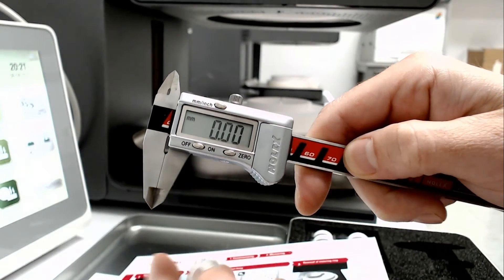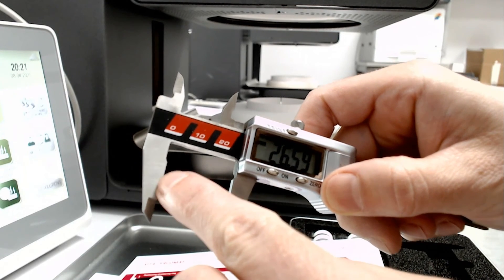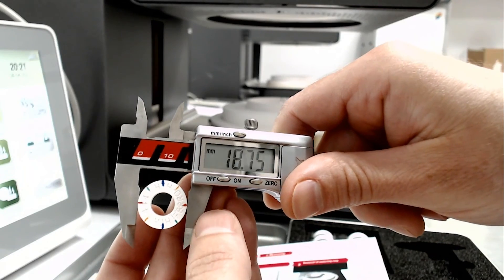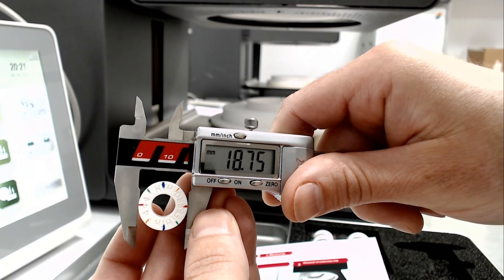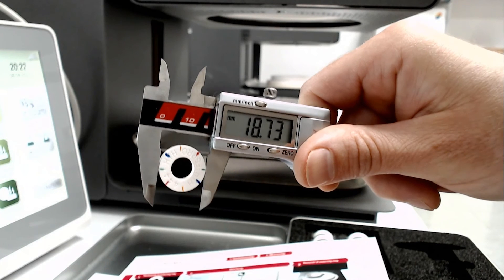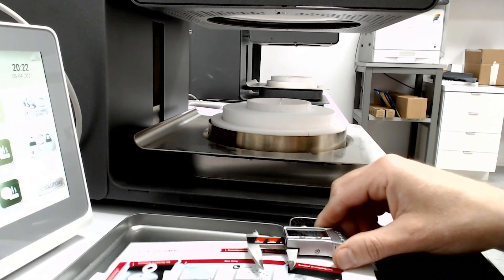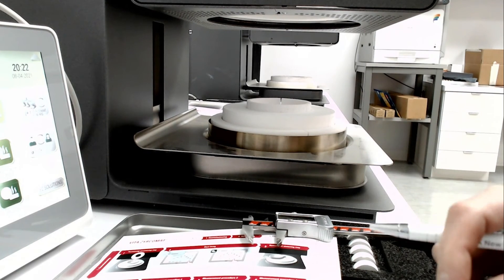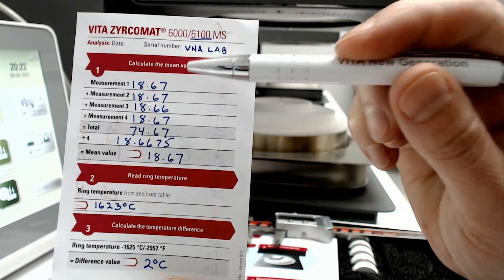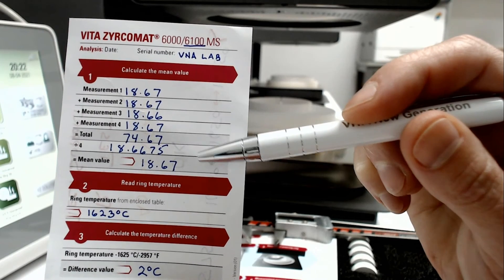Then we're going to measure our ring at the spots indicated. I want to use the flat part of the caliper. I take my first measurement — 18.75 — and another measurement — 18.73. I'm going to keep recording until I have four measurements. The kit comes with forms to record your measurements. In the end, we're going to take an average: total all four measurements, divide by four, and get our mean value.